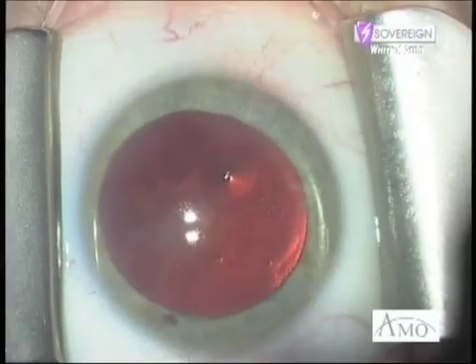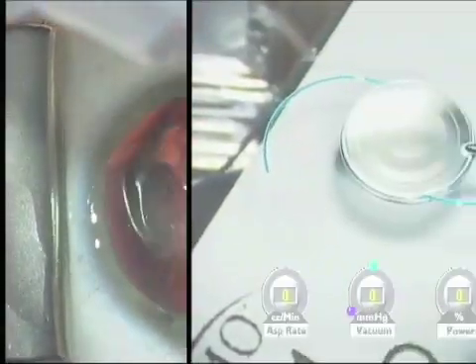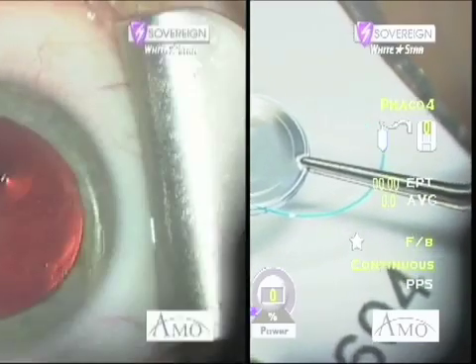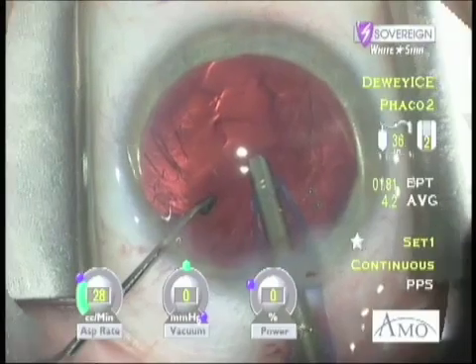Here is a patient with a 2+ PSC cataract with plaque. Seems straightforward enough; however, she has requested an advanced multifocal optic for a spectacle-free result. To what extent can we tolerate anything short of a completely clear capsule to achieve this goal for this patient?